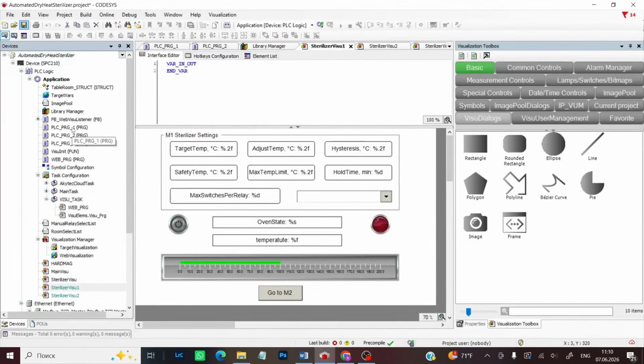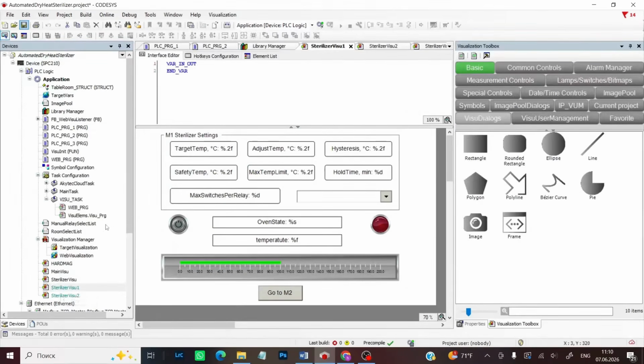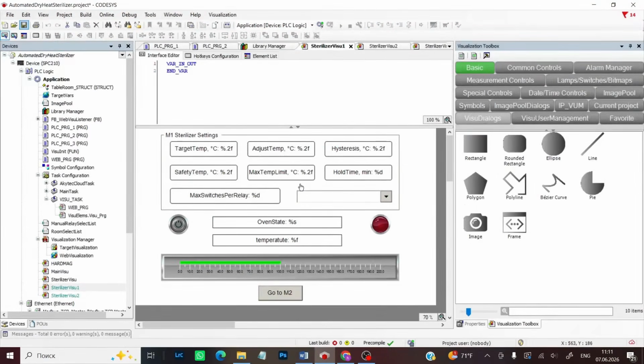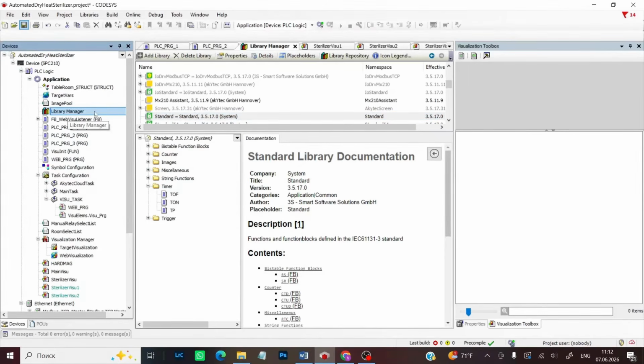In the previous video, to support managing 2 sterilizer models, we duplicated both the source code of the control algorithm and the user interface visualization files. Duplicating the source code of the control algorithm is still somewhat acceptable, since it doesn't really consume much of the limited memory on the SPC210, even if I create 100 instances, but it does make future maintenance more difficult. And we'll solve this problem, but a bit later, by creating our own library, similar to the standard libraries you can see in the Library Manager.